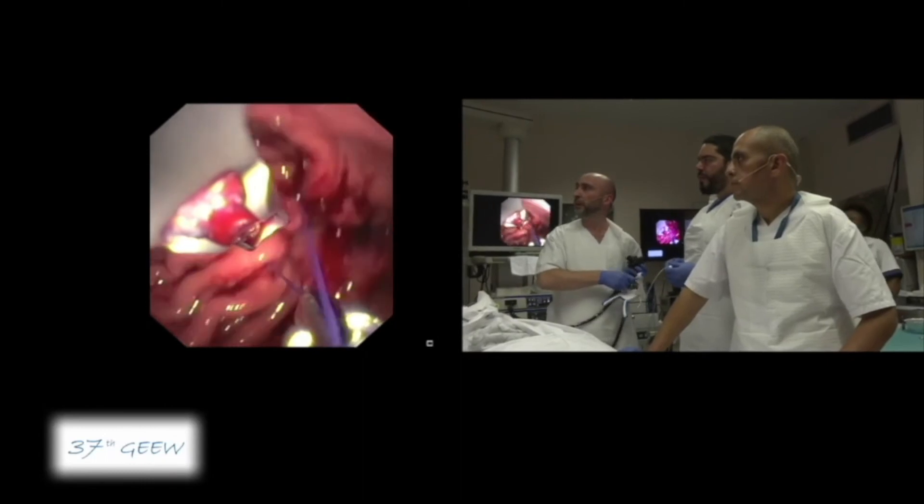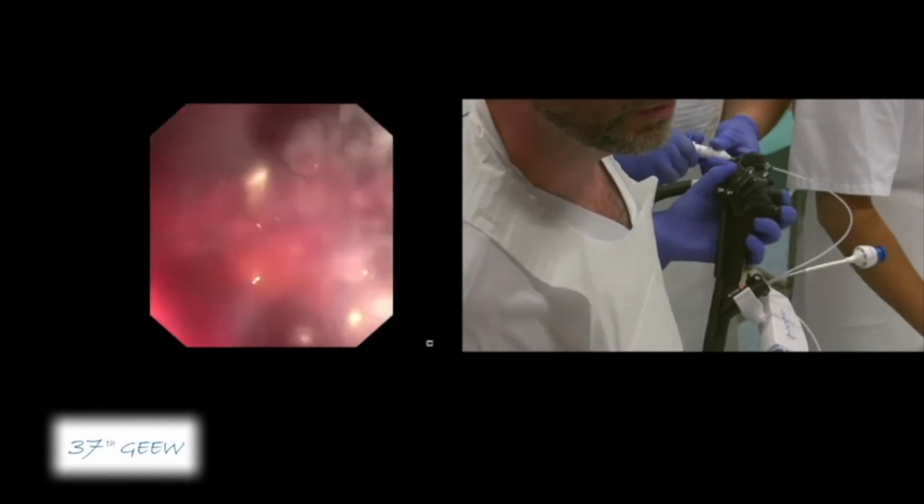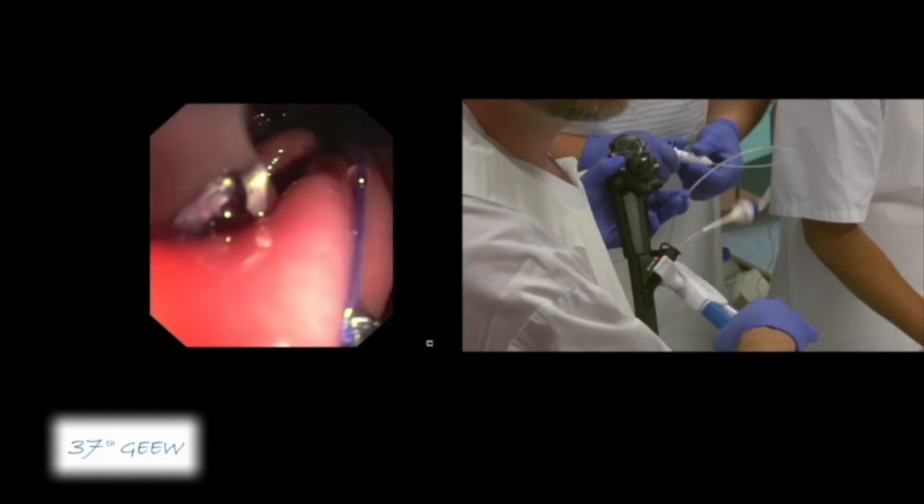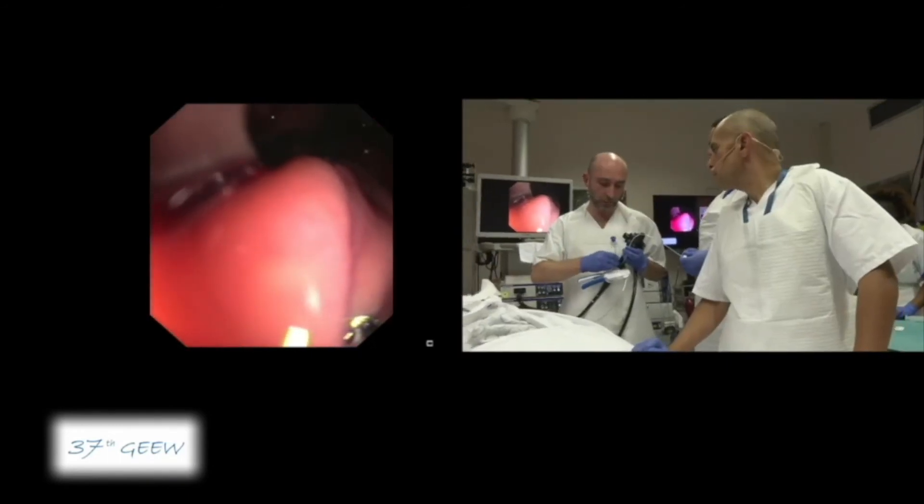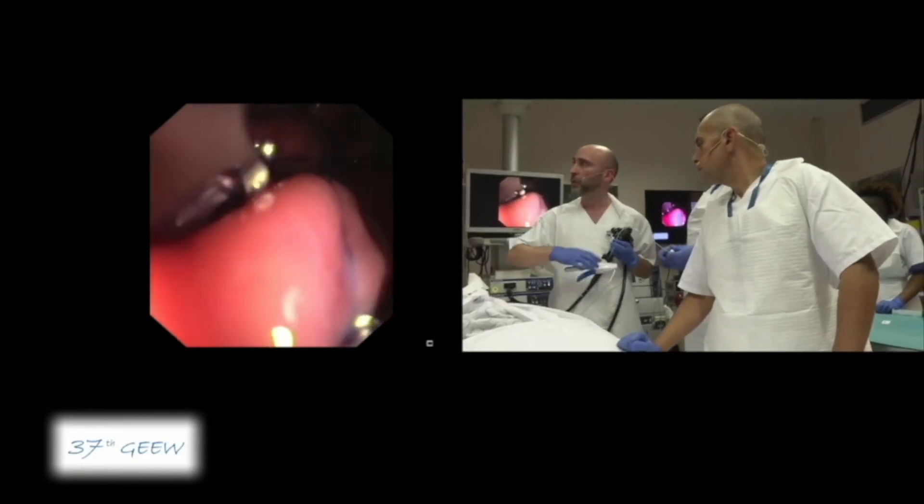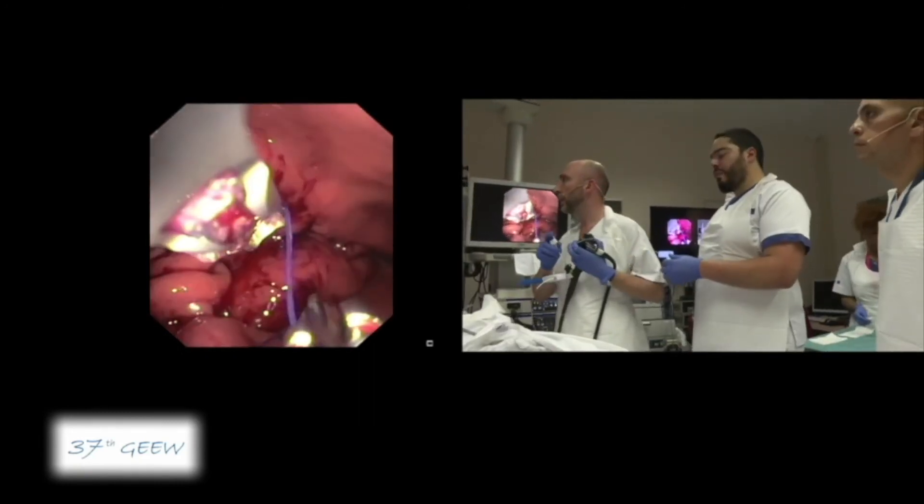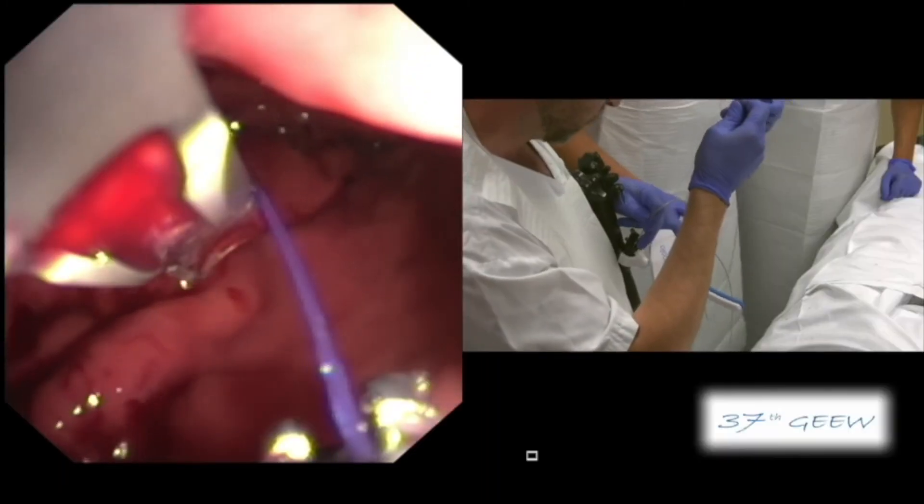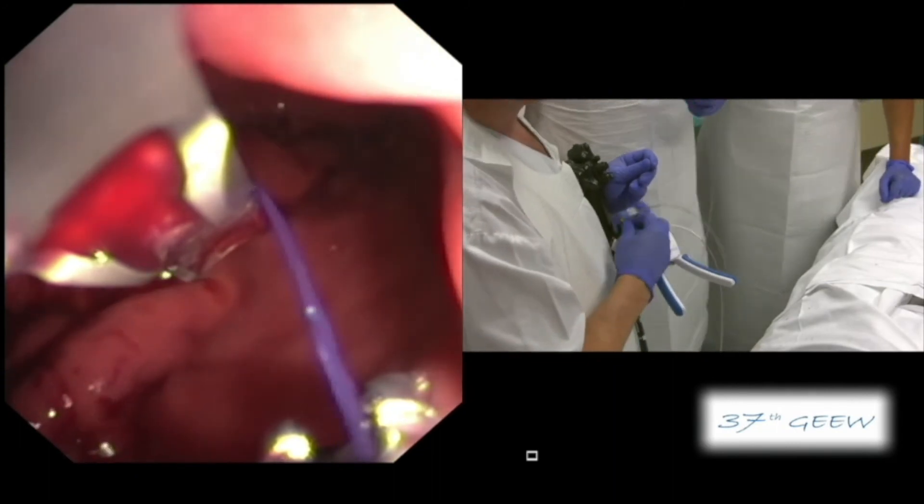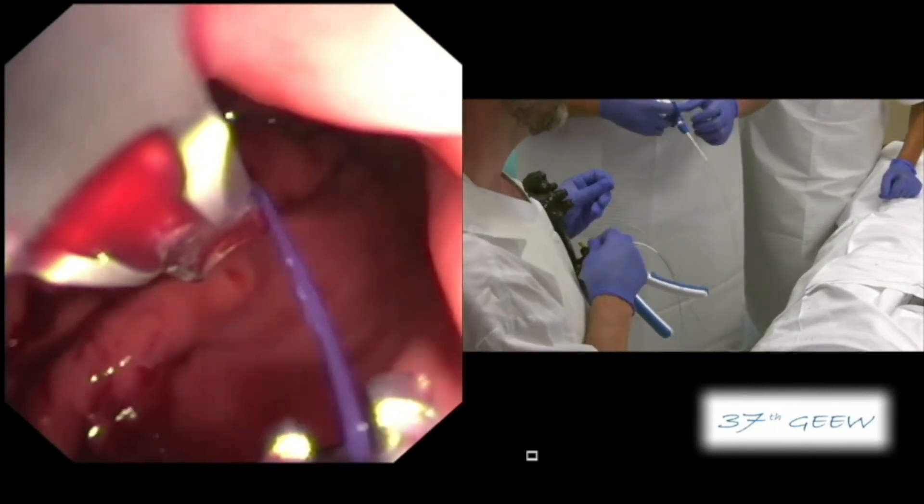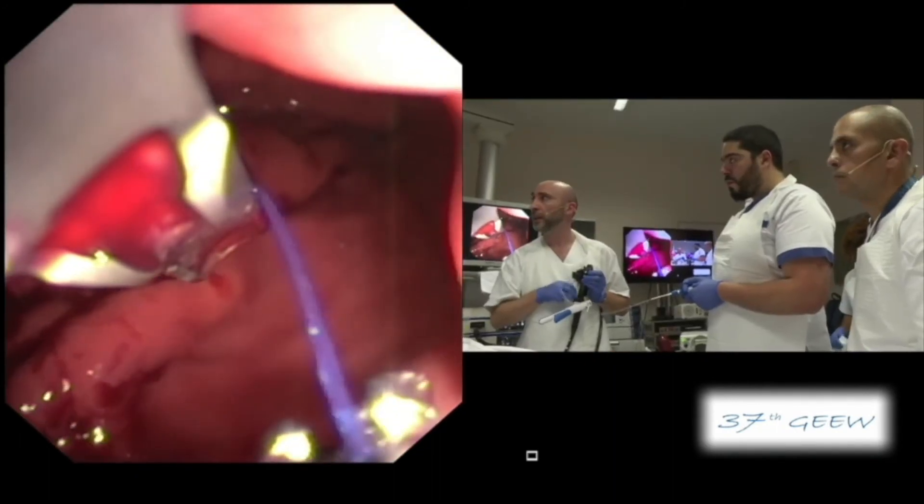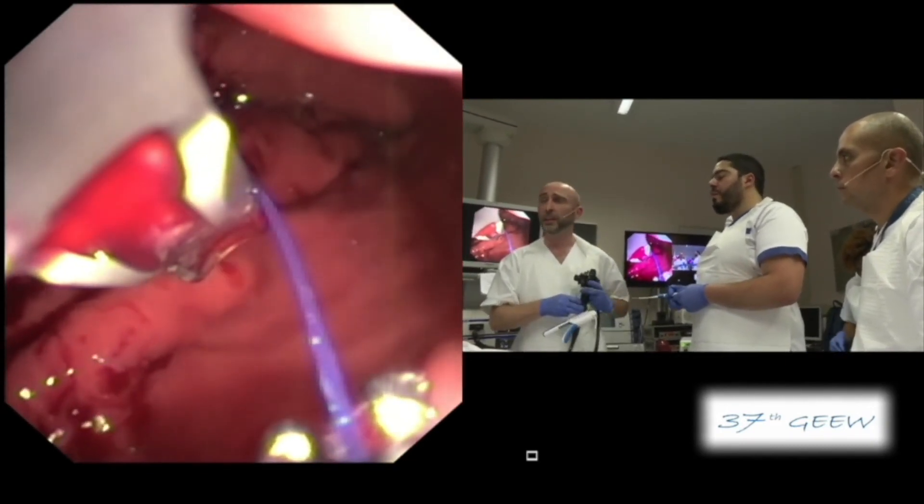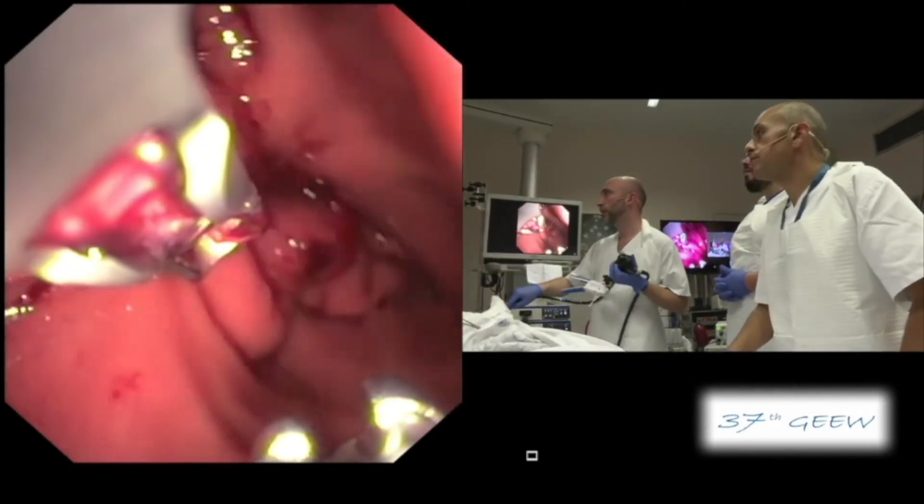This is the fourth one. As we are approaching the fundic area it usually bleeds, but these are mucosal bleedings. So you should usually not worry about it. You see the tunnel can be seen nicely. We never close the fundus. We leave the antrum and the fundus free, which is contrary from surgical procedures where if you don't remove the fundus you will not have results. It's really beautiful. Very nice.